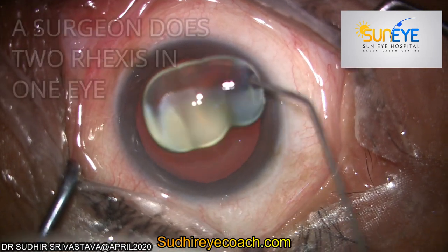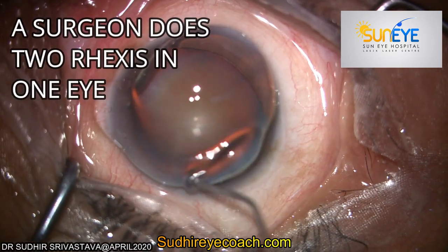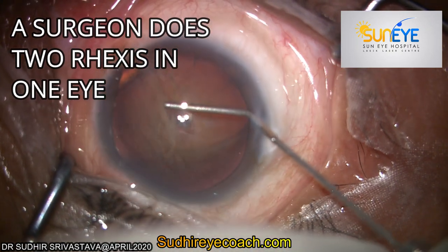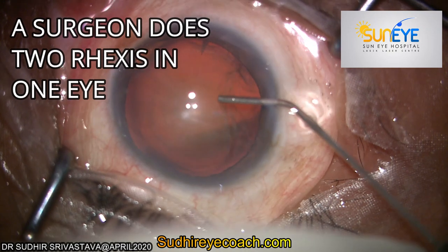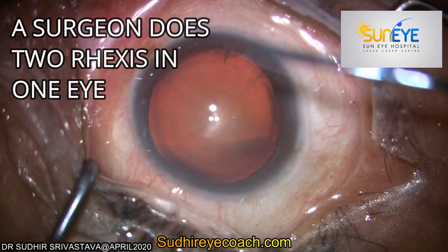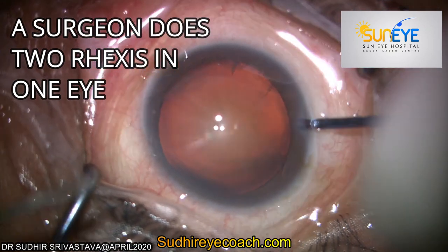Hello everyone. Today I will share an interesting fact that a vitreoretinal surgeon used to do two rexes in one eye. Rexis is controlled tearing of the capsule. For cataract surgery, we open or tear the capsule of the lens, which we call capsule rexis.